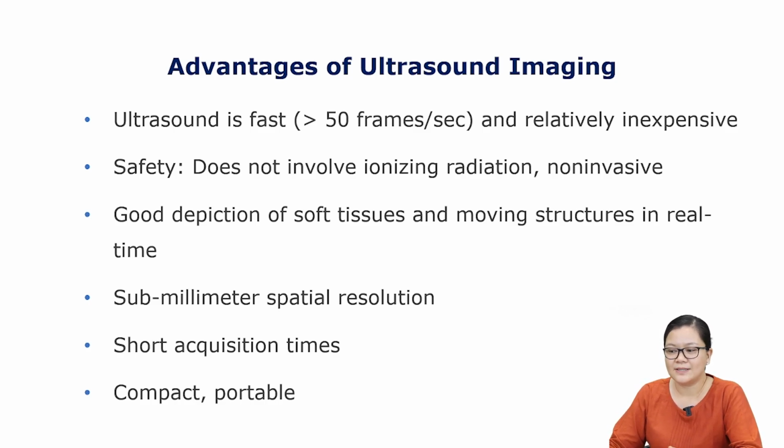Also, as ultrasound is a real-time imaging modality, it allows for short acquisition time, meaning an ultrasound scan can take as little as 2 minutes. And typically, depending on what the sonographer would like to see, it can go up to several minutes, but it doesn't take that long. So it's pretty convenient. And due to the compact form factor of an ultrasound system, it is quite portable and can be used in many regions around the world, especially in rural areas.